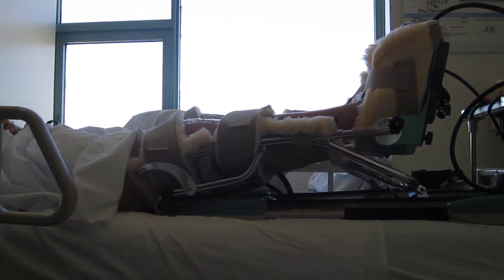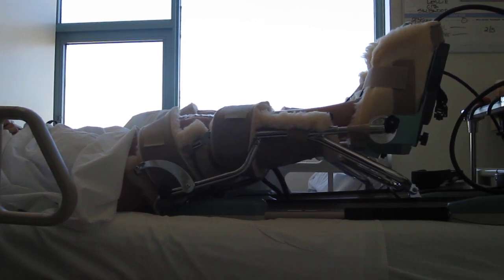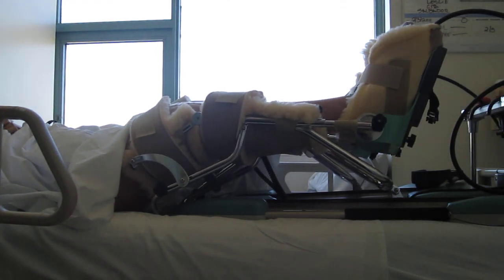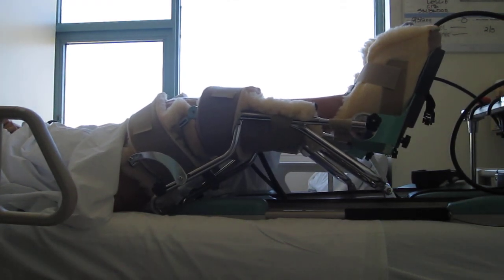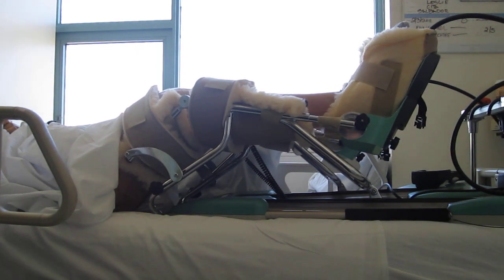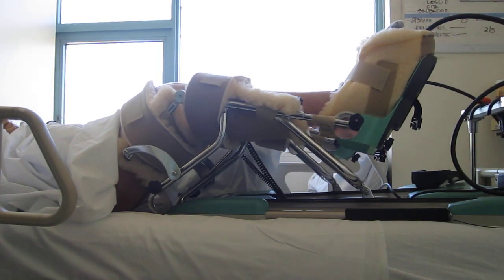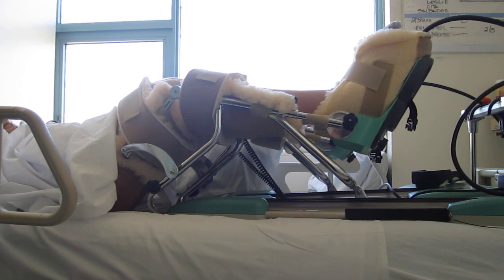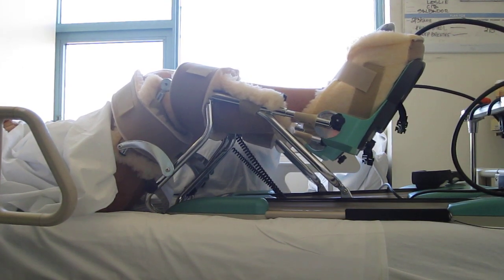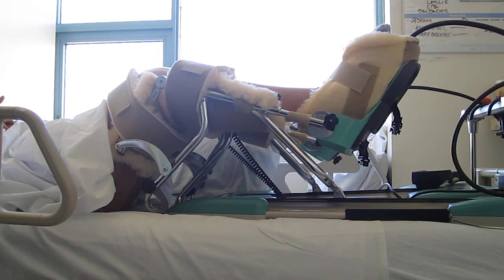The recommended regimen for this patient is 6 hours on, 6 hours off — 6 hours on the machine followed by 6 hours off with the patient laying with towel rolls under the ankles to elevate the legs and to achieve hyperextension, extension of 180 degrees or a completely flat line.